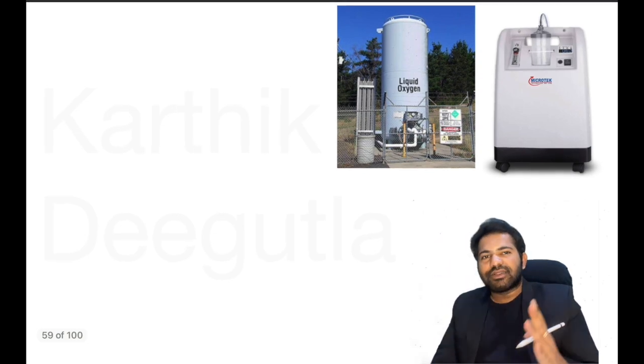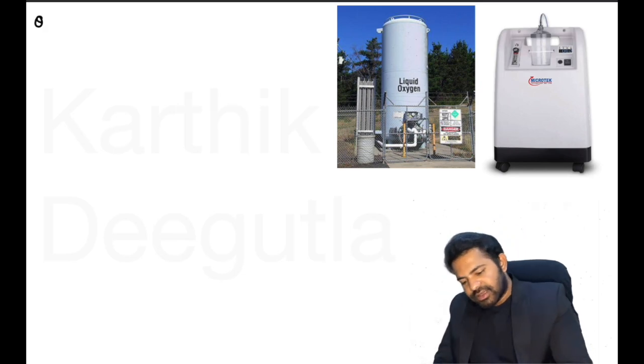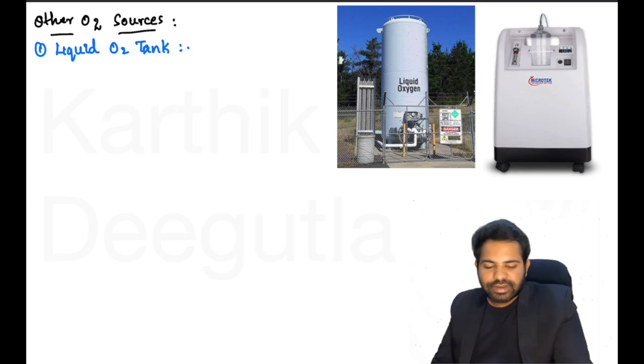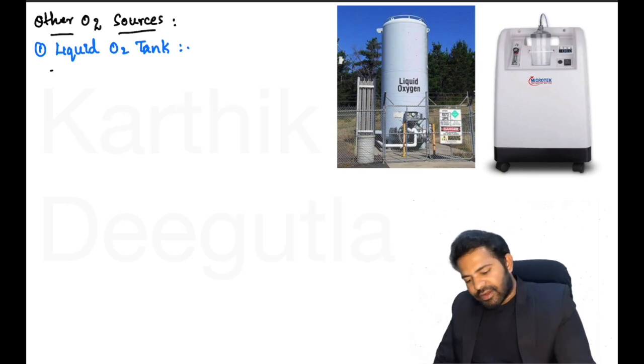Now, what are the other oxygen sources other than the oxygen cylinders in a hospital? The first source I want to talk about is the liquid oxygen tank. Outside your hospital, most of the tertiary care centers also have planted a liquid oxygen tank after the COVID pandemic. So what does this liquid oxygen tank have?